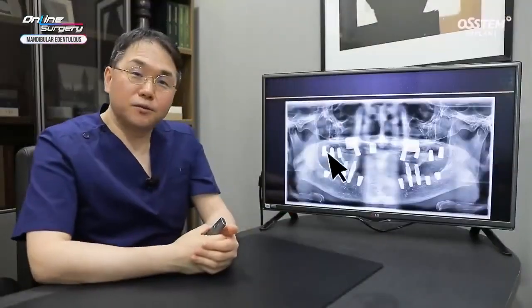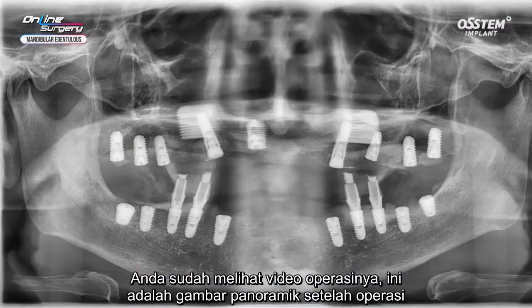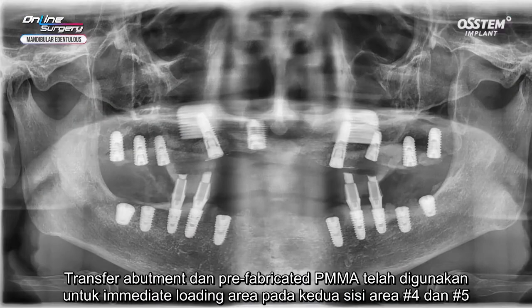You have watched the surgical clip. This is the post-op panoramic image. 10 implants have been placed as planned, number 4 and number 5 on both sides. Transfer abutment and prefabricated PMMA bridge have been used for immediate loading.